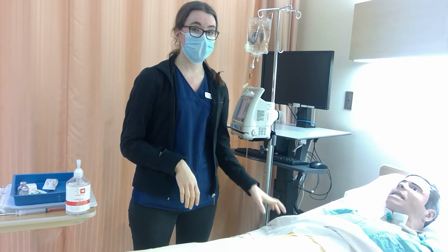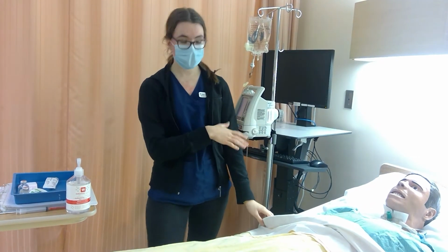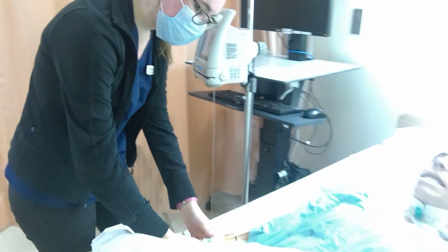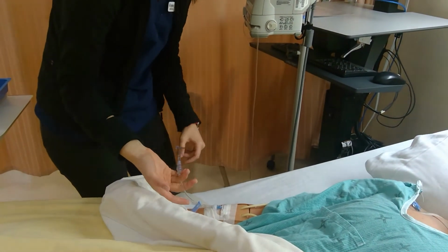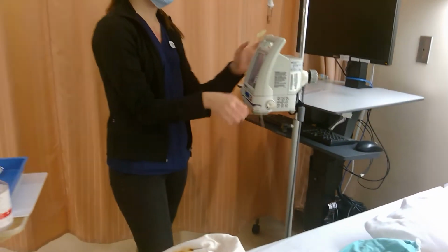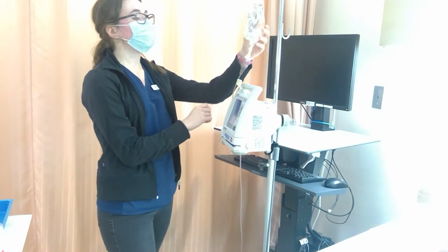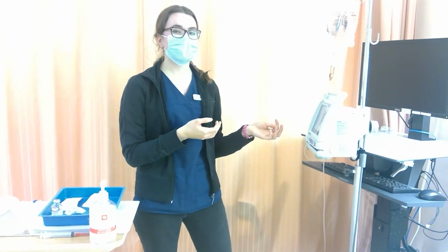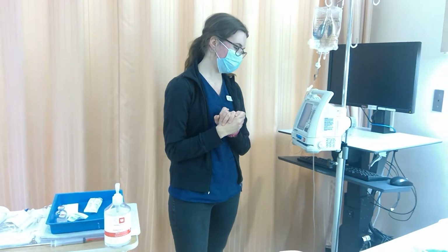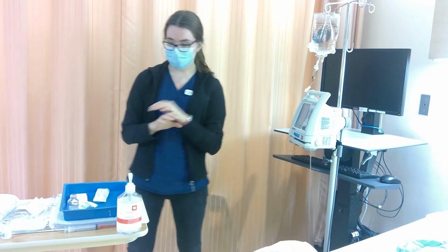So now that I educated him, I'm going to start with the IVs. So I'm just going to check your IV site here if that's okay with you. And I see his IV site looks great. It's inserted. There's no redness, no swelling. The clamps are open. Everything's open, and it is running at 25 milliliters per hour, and it is normal saline. And that's something that I already checked on the MD order before. That's what we were expecting to see, and the tubing doesn't need to be changed, so we are all good to go here.